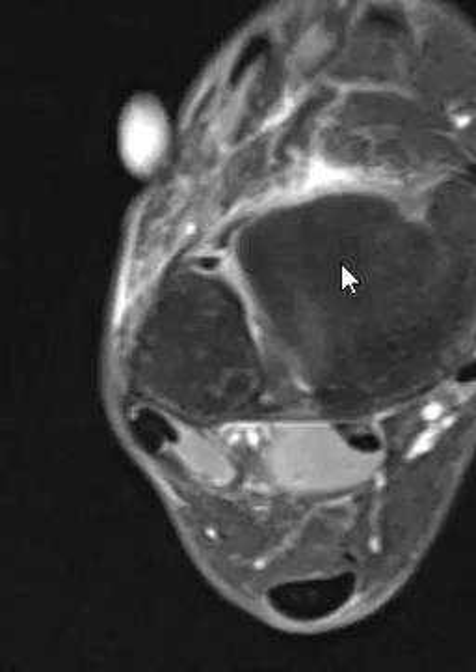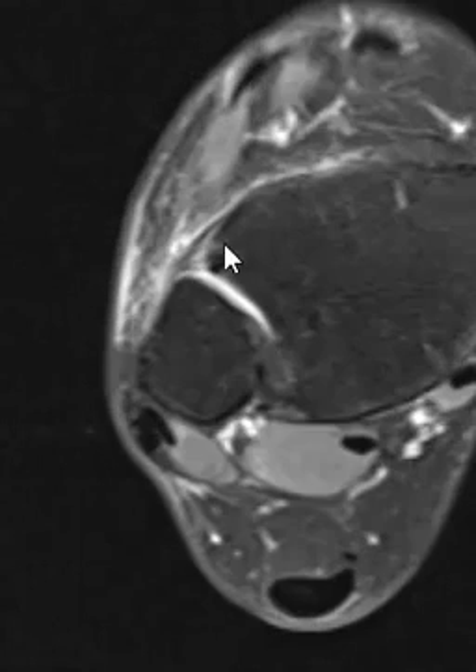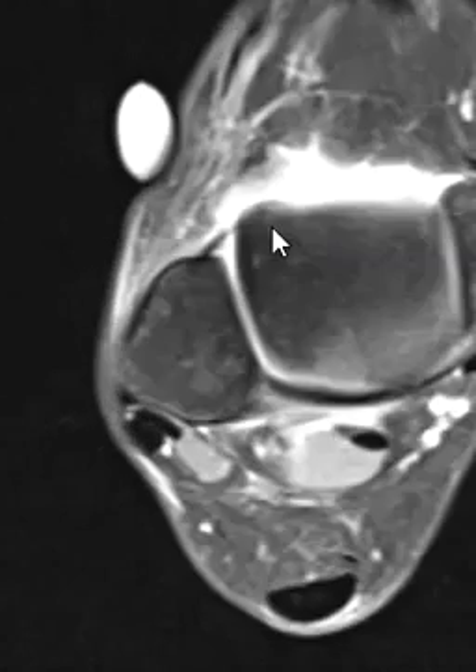Coming up here to the other ligament above the joint, this is the tibiofibular ligament. It's not quite normal — it looks like there is a sprain of the anterior tibiofibular ligament as well.